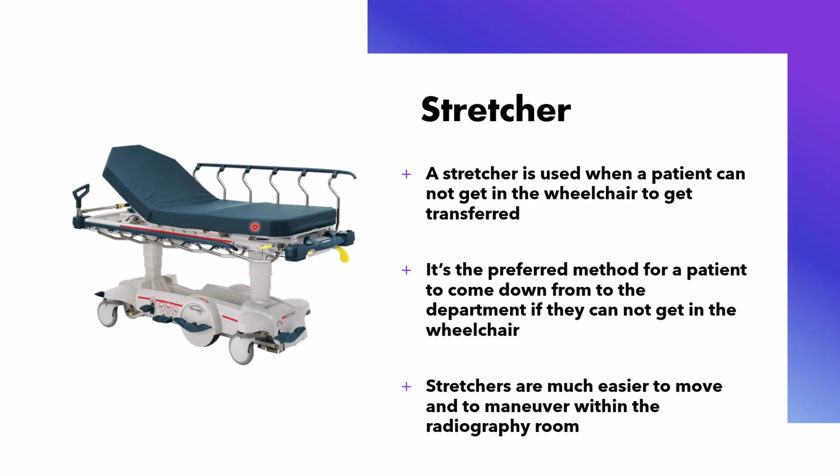You will see gurneys or stretchers in the emergency department at Herman that you can actually put the image detector under here. They're specially made for trauma stretchers. General stretchers are not. We'd have to put the image receptor in front of the pad. On the others, you can go under here, but it's a specially made one.